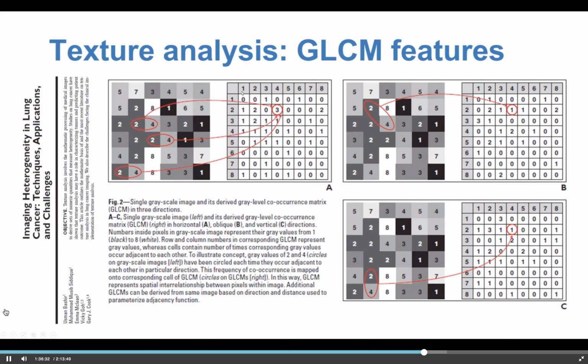So in your gray level co-occurrence matrix, where you plot all the possible grayscale values from 1 to 8, where 2 intersects with 4, it occurs 3 times. And you can see that this matrix actually represents how often different pairs of combinations of grayscales are occurring simultaneously or next to each other. And then you can repeat this in different directions. This just happened to be in the left to right direction, and the top right is in the diagonal, and the bottom right in the vertical direction, and generate more and more matrices. Okay, and you can make these matrices bigger and bigger as you include more grayscales.